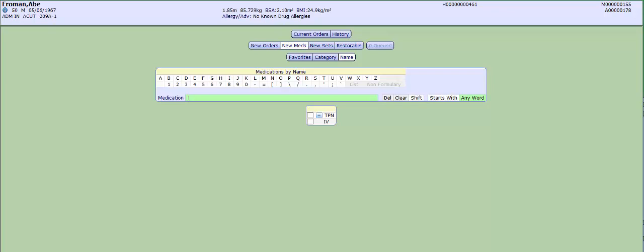The ENGINUITY TPN module fills a unique gap within the MEDITECH system by providing real-time calculations and clinical decision support at the time of order selection, not after the ordering protocol has been completed. The TPN module can be used with custom or pre-mixed bags, and the calculation algorithm is designed using ASPEN Guidelines.